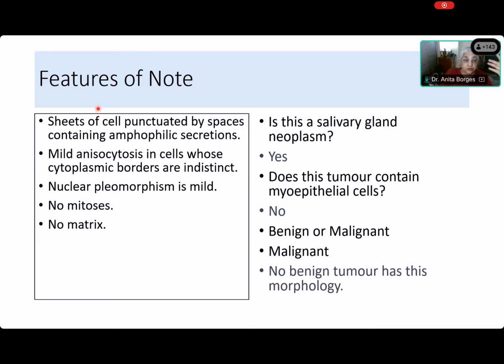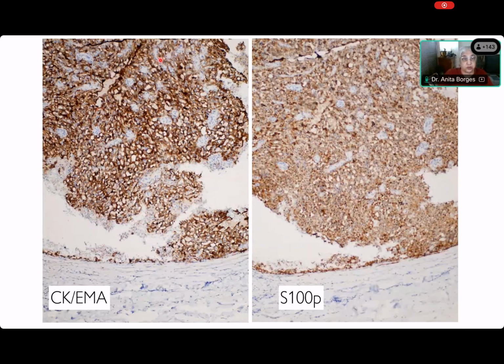Then you go to find out what kind of tumor it is, and I told you it's a secretory carcinoma. And here is the immunohistochemistry, which you do not require. It is CK and EMA positive. If it was only CK positive and not EMA positive, then we'd have to think, is this some funny myoepithelial tumor or not? But it is both CK and EMA positive. That happens in all luminal type epithelial cells. So this tumor is showing differentiation only towards luminal type cells. And then, of course, it has S100 protein.